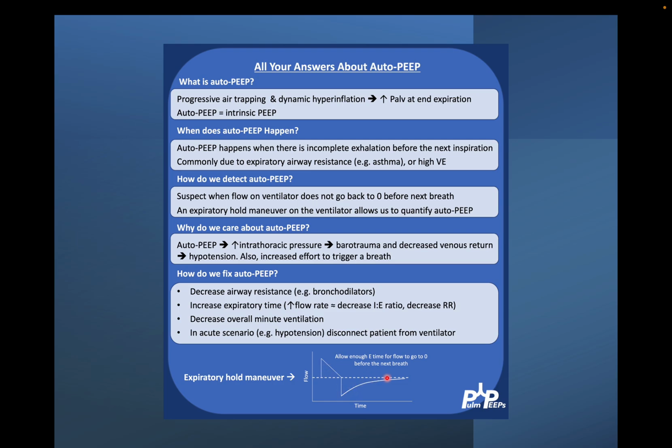So allow enough time for expiration. If you don't allow enough time and give the next breath too early, it causes auto PEEP. So this is the thing.